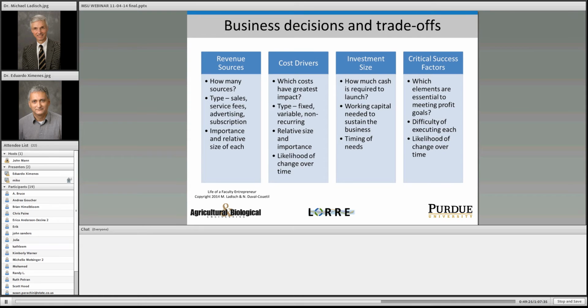And the other things we're looking at is cost drivers. Cost is going to be critical in this application. The costs must be measured probably, we're guessing, in the range of dollars per sample for this to even be considered by the industry because of the large number of samples that ultimately would have to be tested. And as we all know, there's a large and viable segment already which does testing of food products for the presence of bacteria, for the presence of pathogens, and so forth.